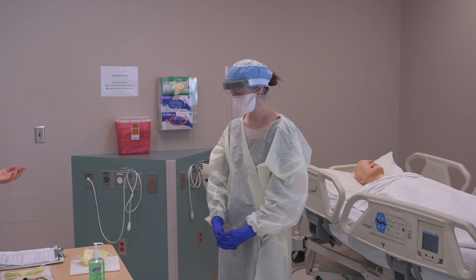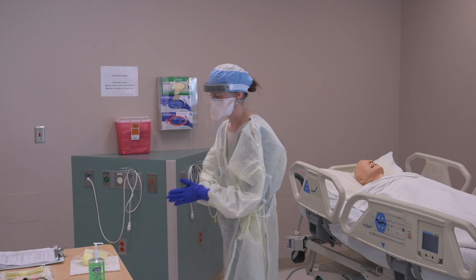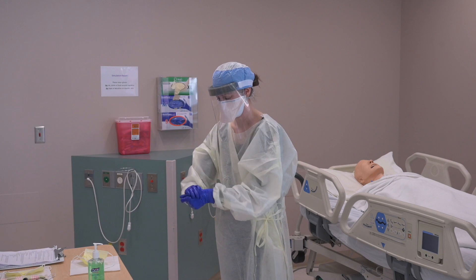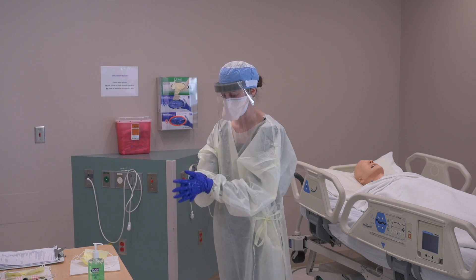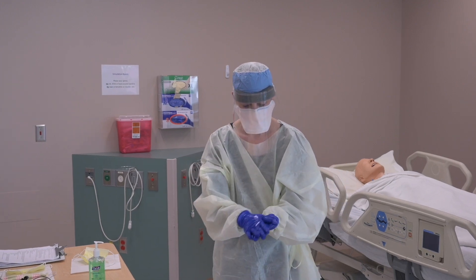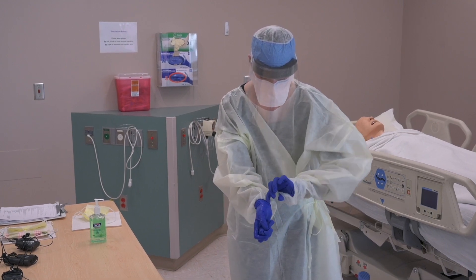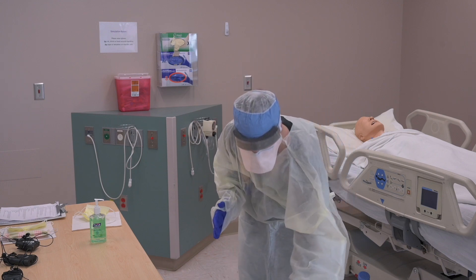Now we're going to talk through the doffing process — the taking-off process. First thing you're going to do, Brooke, is perform hand hygiene. Then you're going to doff that external pair of gloves using the glove-in-glove technique. Gently discard those and perform hand hygiene.